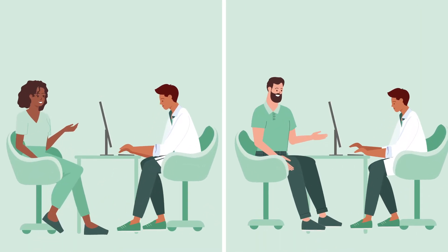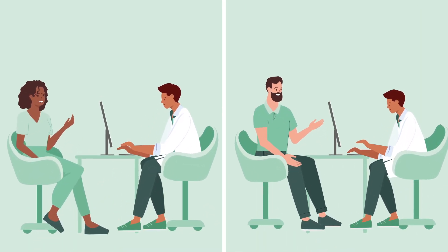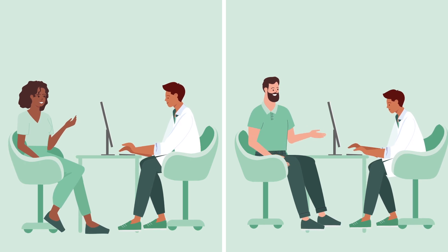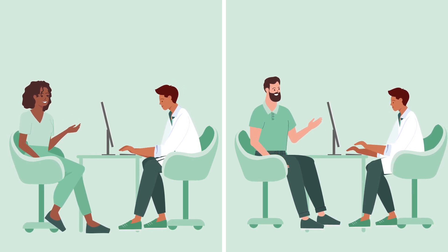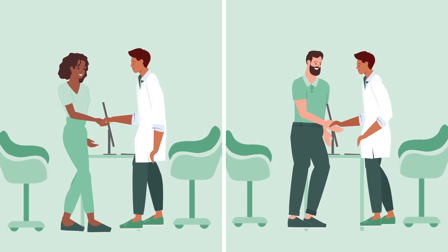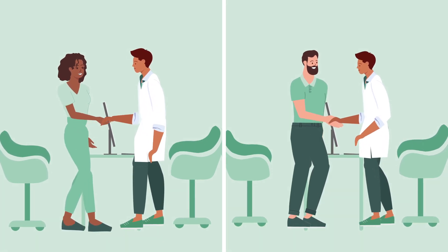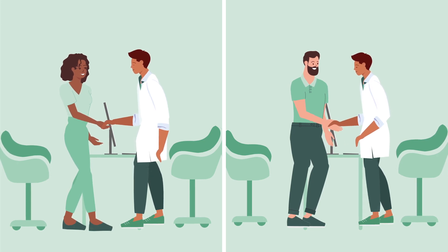This means that both Penny and Raul can benefit from a personalized hearing aid fitting, which optimizes the hearing aid technology for their individual needs, giving the best possible outcomes from their hearing aids with around only two additional minutes of testing.